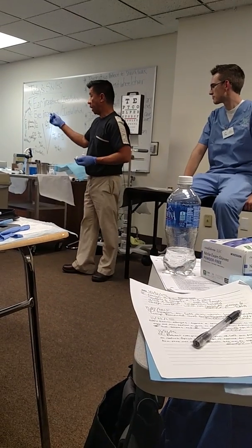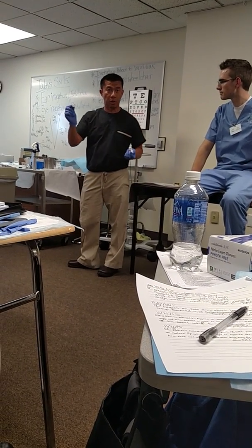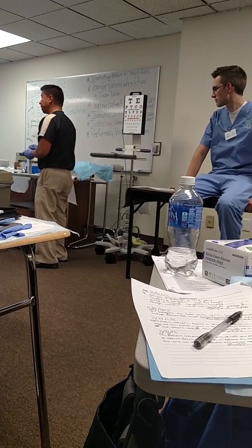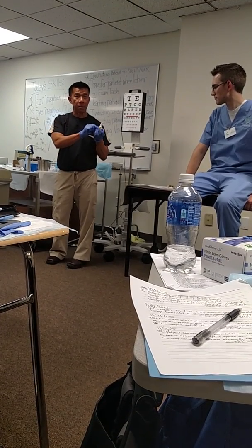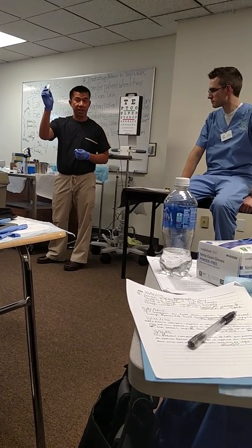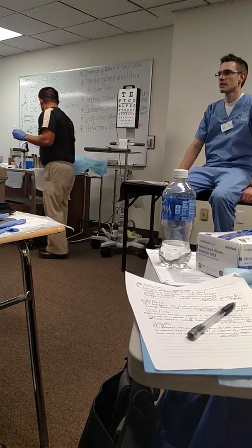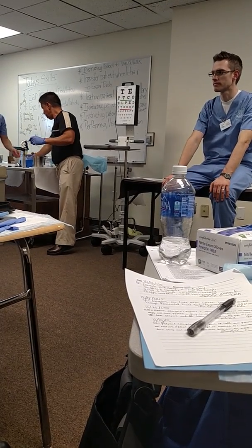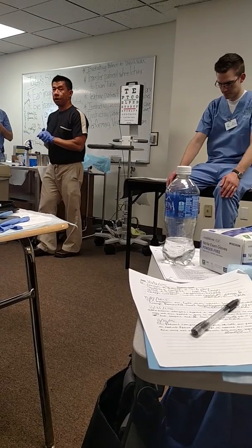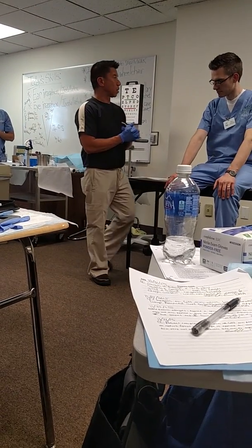You want to make sure you don't lay this in a corner anywhere. This is non-sterile because then it will contaminate the medication. Always be mindful, this is new medication. I'm going to initial with my name, the date, and the time that I opened this. Are you guys with me? Can you initial the bar? Yeah. All right. Now I'm ready to irrigate the ear based on the doctor's order.